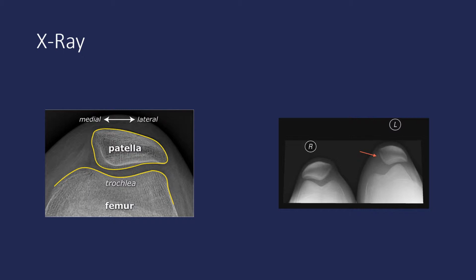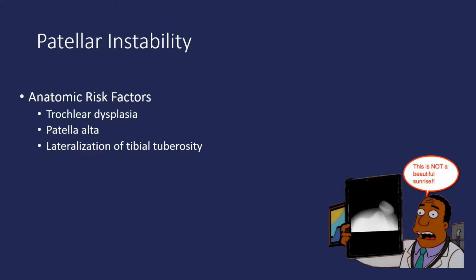patients with patellar instability. These are the three primary anatomic risk factors for patellar instability. We're going to touch on each of these individually.